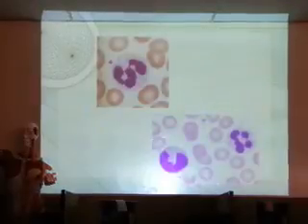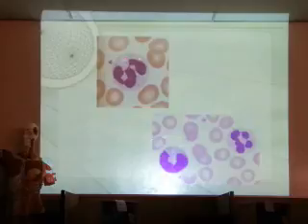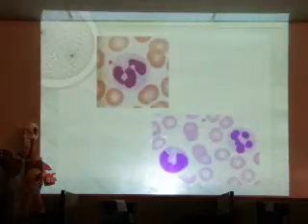Okay, more examples of a segmented neutrophil. On the top, this is a very obvious segmented neutrophil, pretty healthy looking. This one also looks healthy, and you can see that neutrophils tend to be a little more lobulated than eosinophils. They may have 3 lobes, may have 4 lobes, generally not 5 lobes. Five or more sometimes indicates that the patient has some kind of disease process.